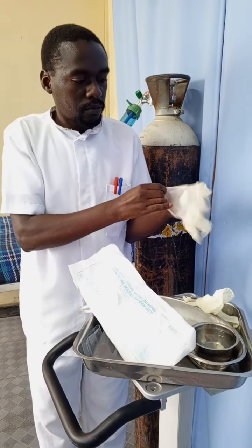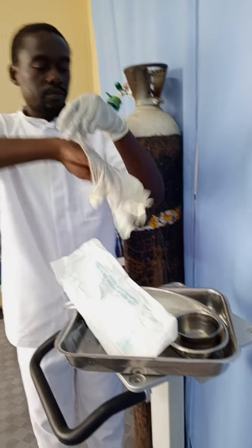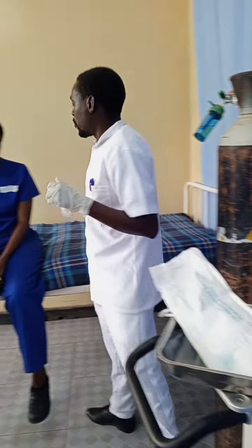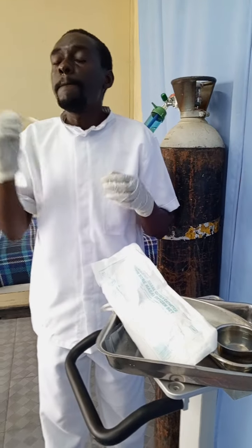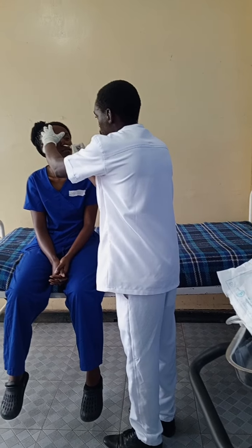So I've washed my hands. Now I'm going to don my gloves. After donning my gloves, I'm going to inspect the patient's nostrils. From there I'm going to get an orange stick with sodium bicarbonate, used to clean the patient's nostrils. So I'm going to clean the nostrils.